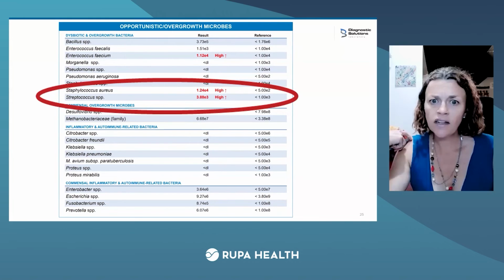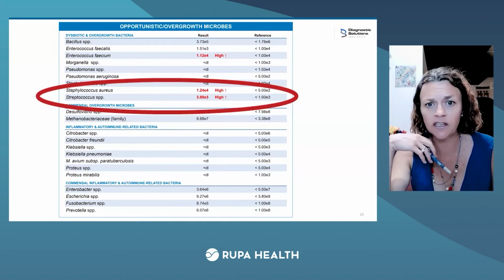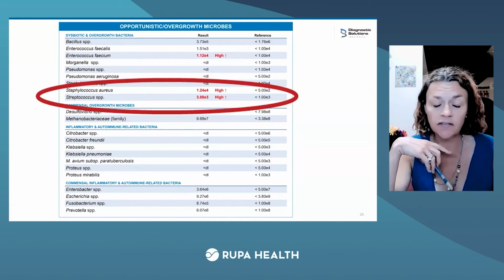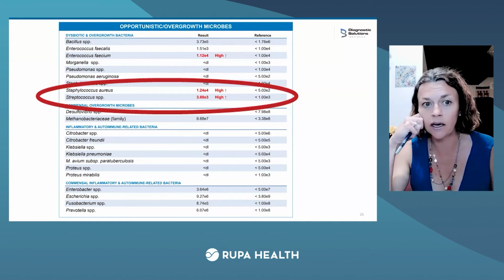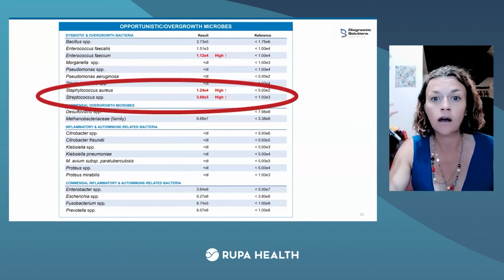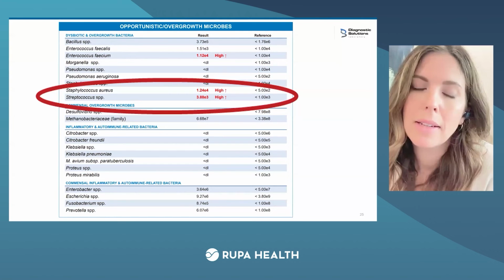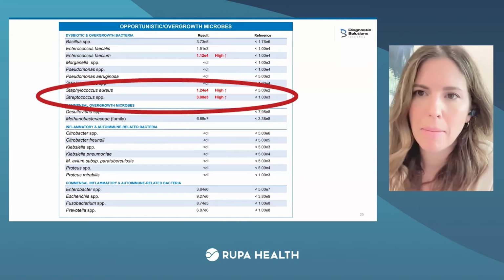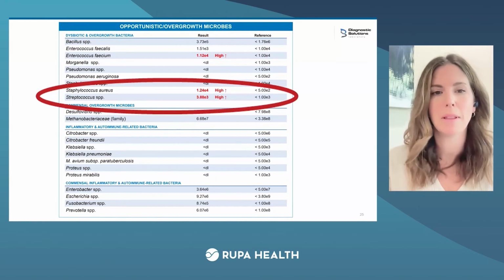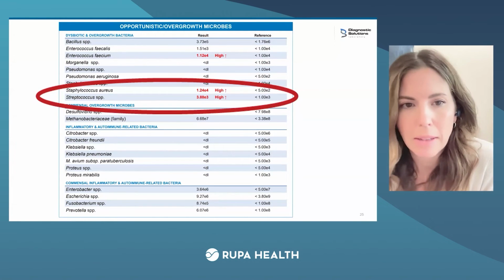eczema. Yeah, that's an extremely high Staphylococcus aureus E4. And my understanding of eczema pathophysiology is that Staph aureus specifically is really one of the major villains of eczema, if you will. And it's a mast cell activator and also a very pH sensitive organism. So that, I would say, in this case is definitely one of the more remarkable findings thus far. We're not all the way through, and sometimes you'll see it culturing on the skin too. Yes, Staph aureus does not always mean MRSA. It would fall within this, but this is not guaranteed to be resistant to antibiotics. Most commonly, it'll be sensitive.